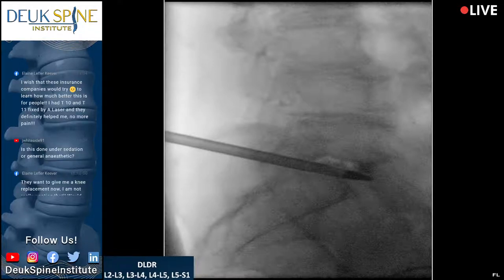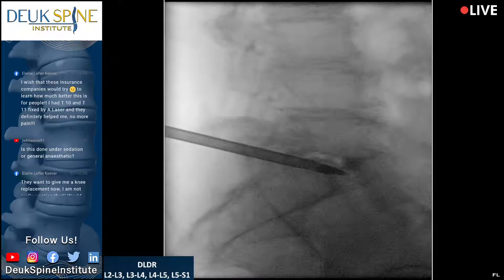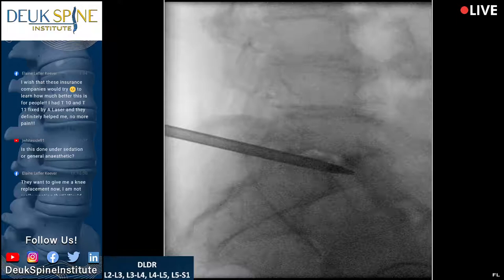Okay, so just laying here? Yeah. No problem. So we got a little bit of tissue caught here. We've cold welded the dilator and the tube. Now I've got to separate them. That should do it. All right, I'm going to advance both one more time, and then we'll get the dilator out. Perfect.